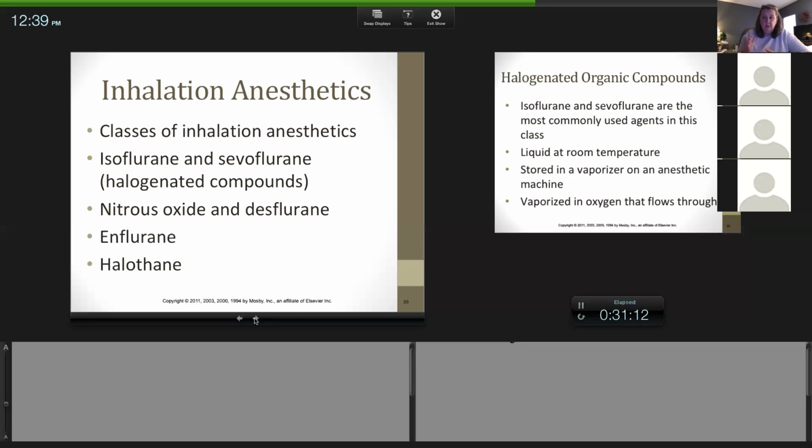Hopefully clinics will start to order these and add them in. I think it's nice that we have them at school. I just don't think a lot of practices are going to have them. So when you squeeze a non-rebreathing bag, I just look at their chest and get an idea of feel. You're not wanting to blow their chest up.